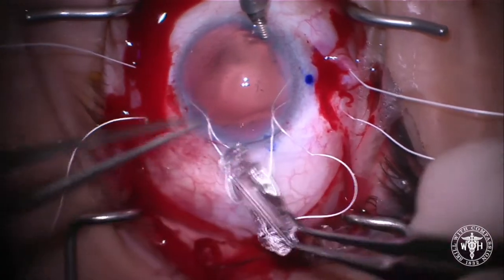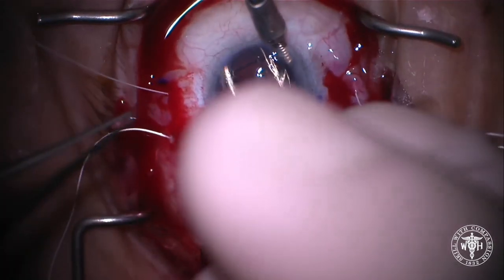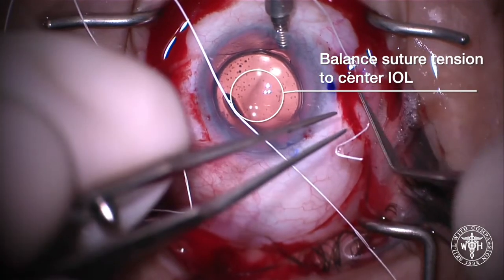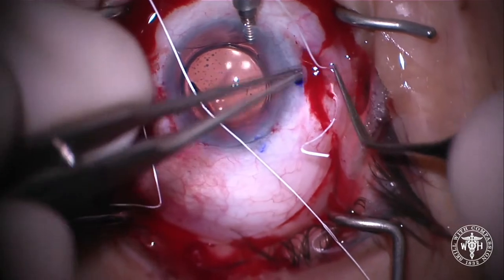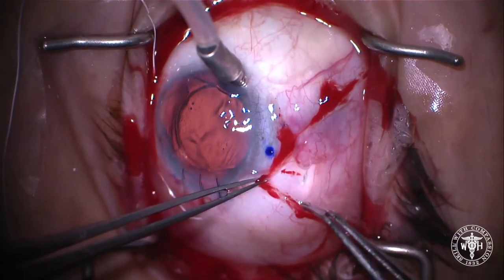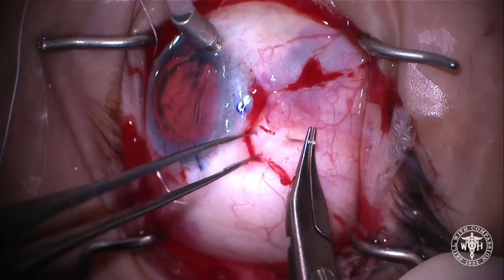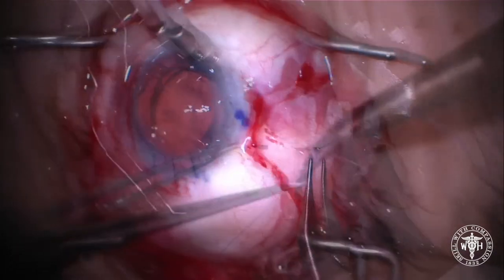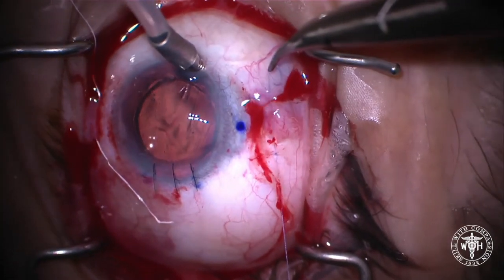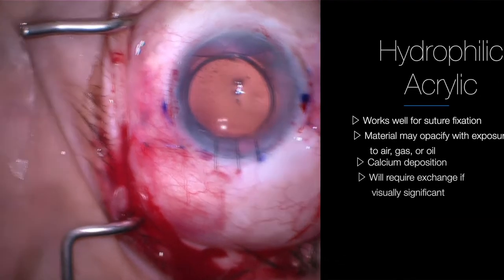We've got our four sutures placed. We're going to fold the implant and put it in the posterior segment. Notice the trocars have already been removed — the trocars will hold the implant back and give you a funny-looking position of the implant. Using sliding knots, we balance our suture tension with infusion on during that balancing procedure. You don't want that suture too tight. Bury the knot into the sclerotomy, and then close the sclerotomy — that prevents a wound leak and prevents the knot from becoming exposed down the road. Here's the case at the end with a nicely centered implant.